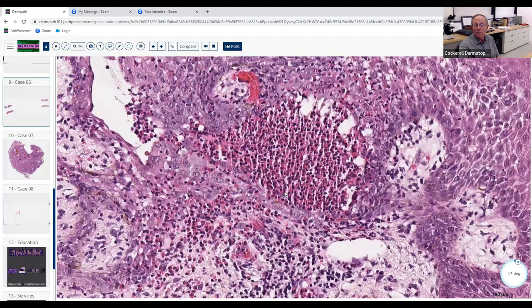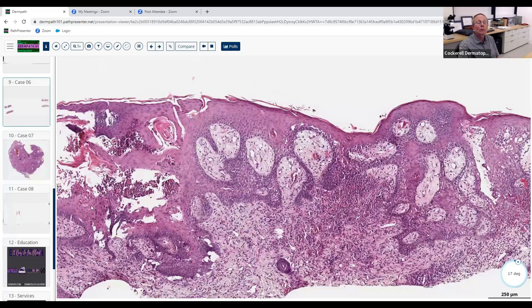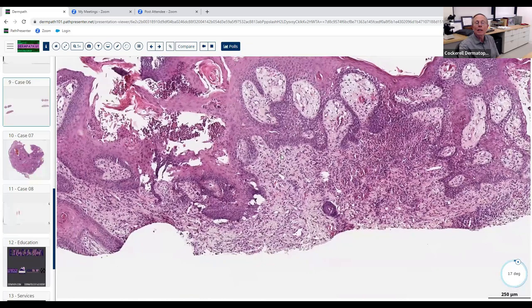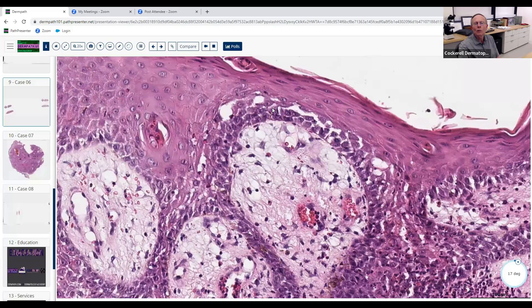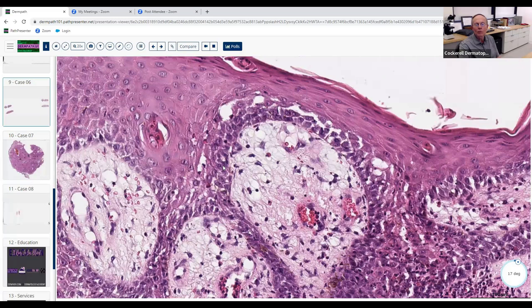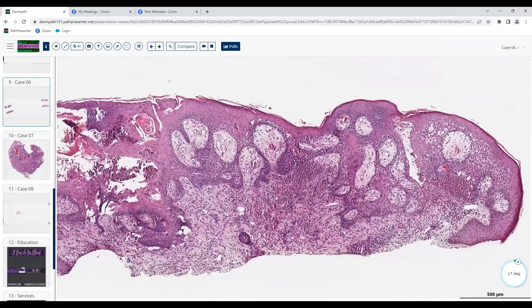There are a few acantholytic cells here, and a lot of spongiosis — but some of this is acantholysis, which would favor pemphigus vegetans. I agree that all of this markedly thickened epidermis is pseudocarcinomatous hyperplasia, which also favors pemphigus vegetans. The tricky thing about pemphigus vegetans is the acantholysis can be masked by the dense eosinophilic infiltrate, but if you look carefully you can find cells that have truly lost their intercellular bridges and fallen into small clefts.